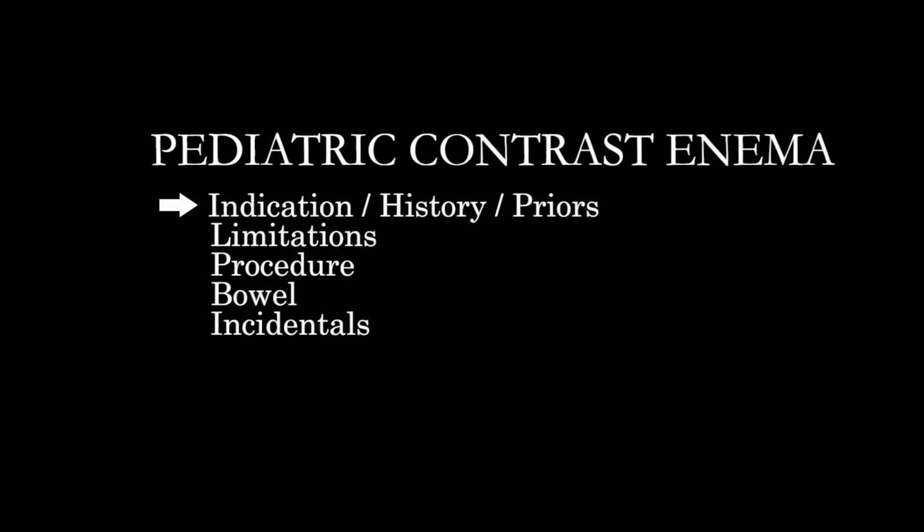Sometimes these sorts of exams are done in slightly older patients, if there was necrotizing enterocolitis and you're looking for strictures, or even older patients if you're looking for a late onset Hirschsprung's disease. This video is going to focus on the first of these circumstances, looking for distal obstruction or functional obstruction in the intestine in neonates.